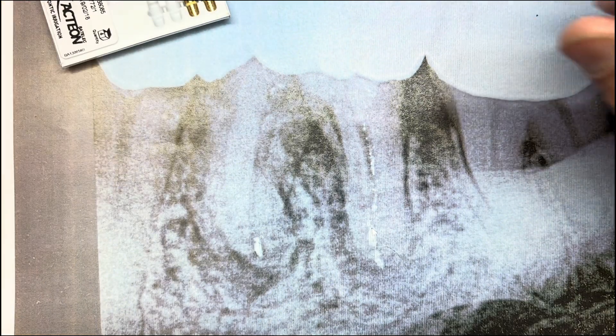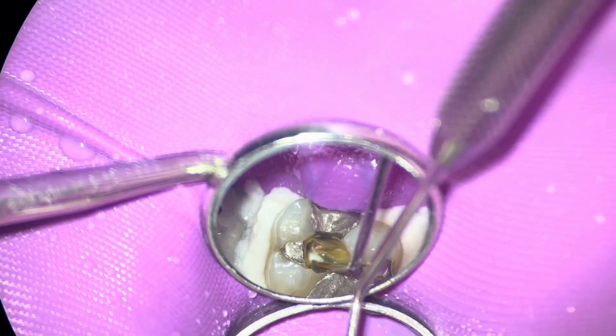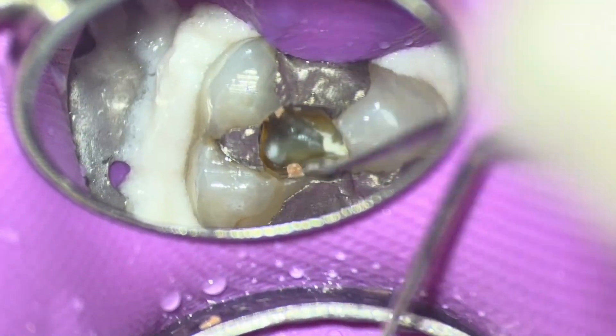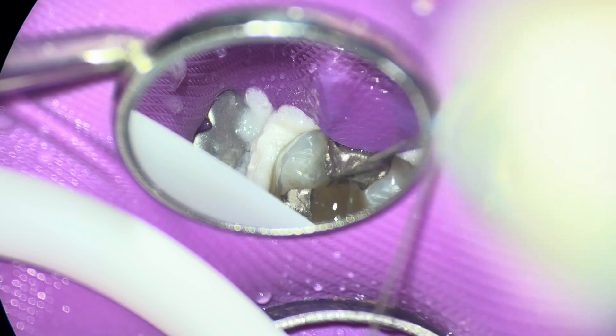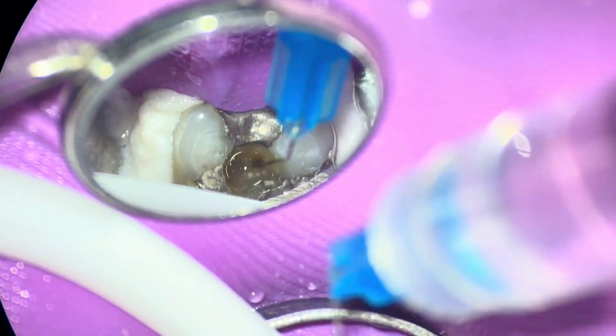Prevention is obviously the best. When I was doing this pulp, going into stage two of a pulpectomy, there were little bits of debris from the restoration. Irrigate with either EDTA or sodium hypochlorite just to flush all of the debris coronally and make sure it doesn't go apically.